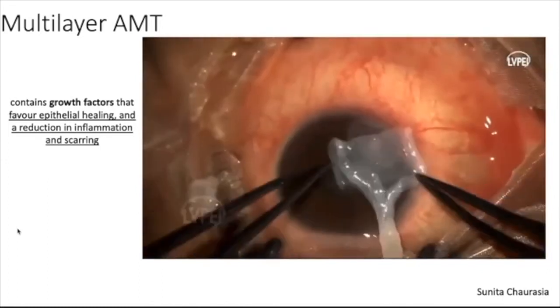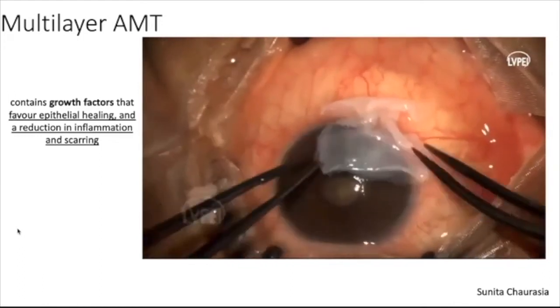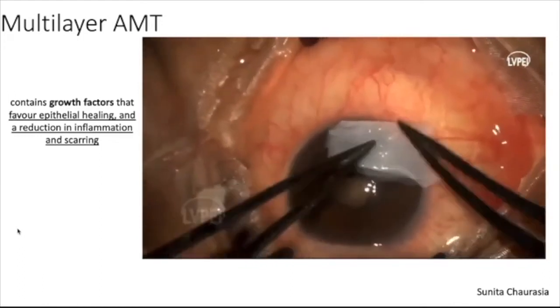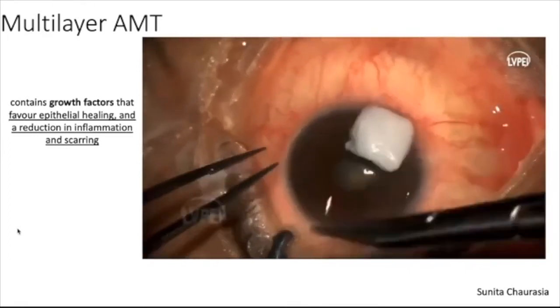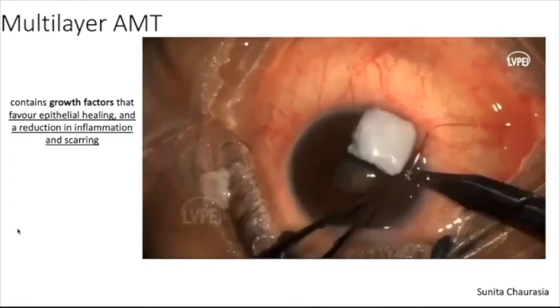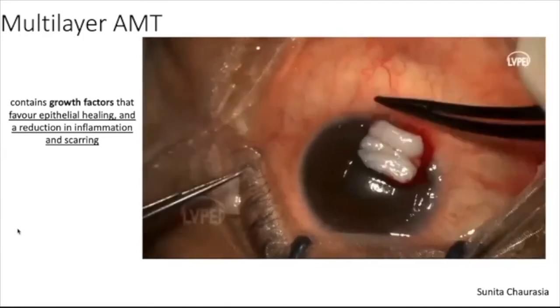It's not possible to do at the slit lamp, it requires some skills, but this is to show that a multi-layer amniotic membrane transplant is beneficial for the patient.